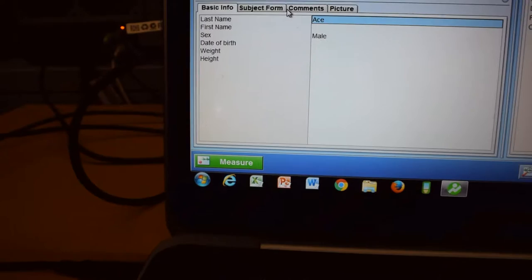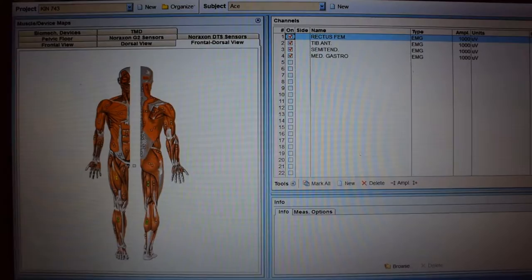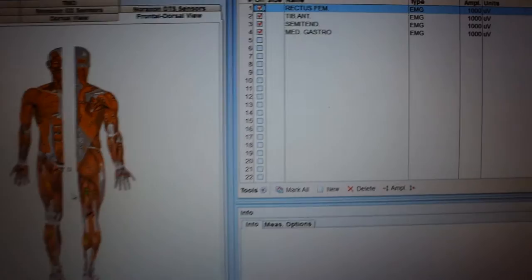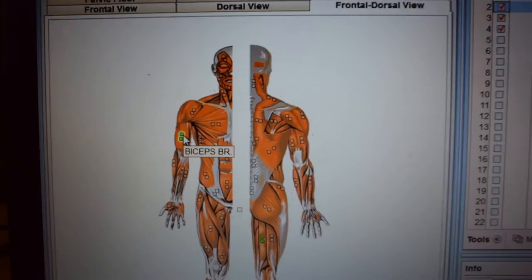Once you hit this part, the most important thing to click on is down here. You want to click on Measure. And this will bring you to a page where we can tell it how many channels we have, how many EMG signals we want. And for this tutorial, we are just going to do one. So we are going to make sure that the first channel is highlighted, and then we are going to select the corresponding area.